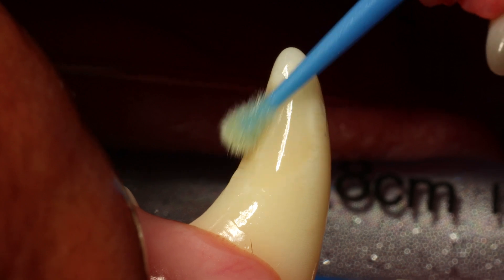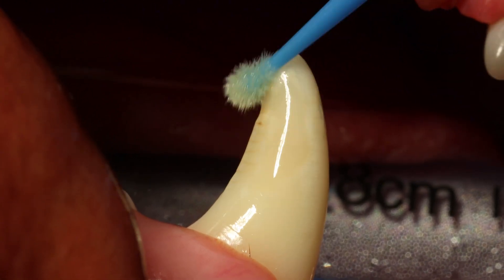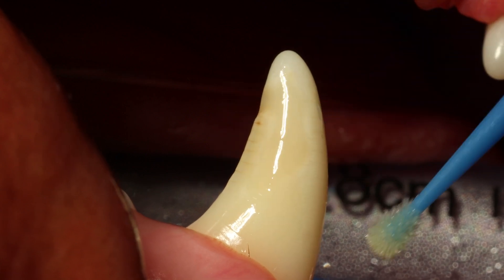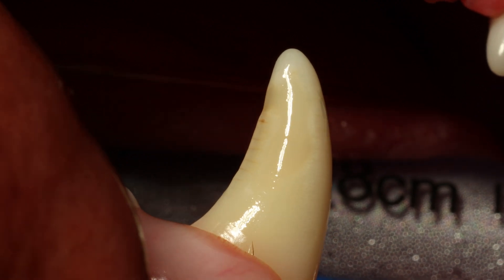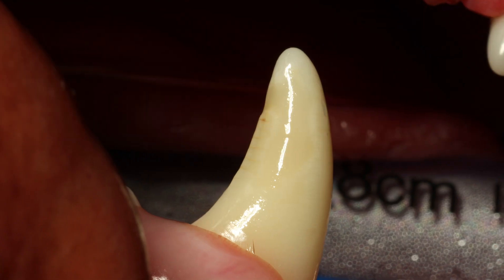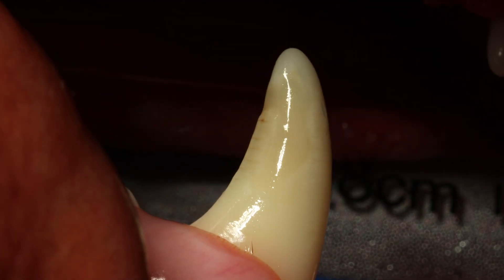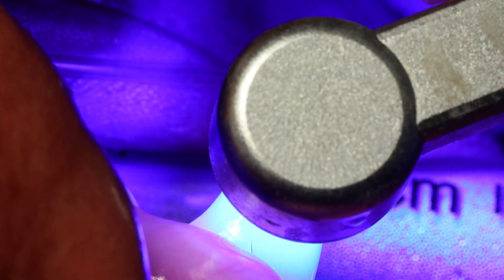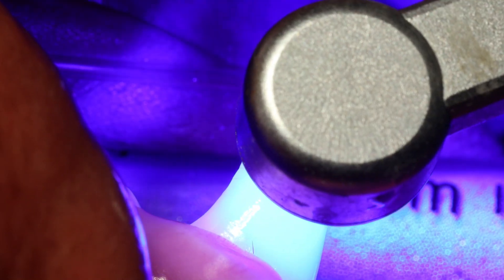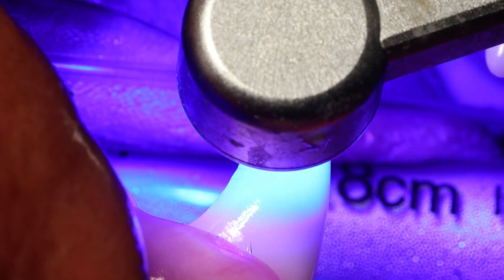This is some unfilled resin — again the Futura Bond M+. The reason we apply this is that when you light cure the composite it will shrink just a little bit, so in theory there will be a very small crack around the edges. You want to fill that with the unfilled resin to make sure the surface has been completely sealed. Then you light cure again for 5 to 10 seconds.